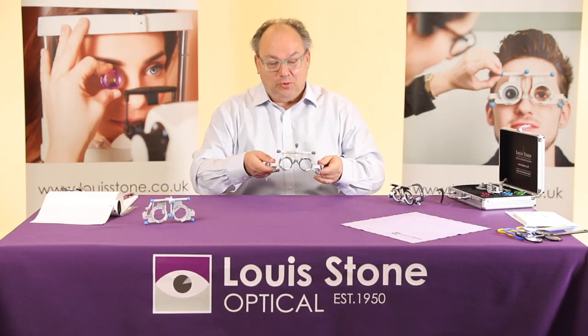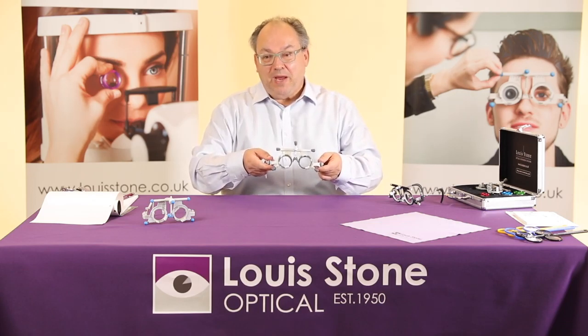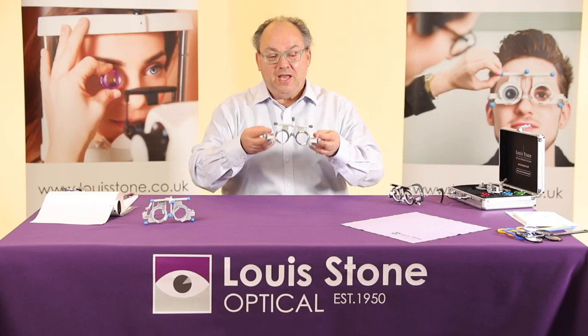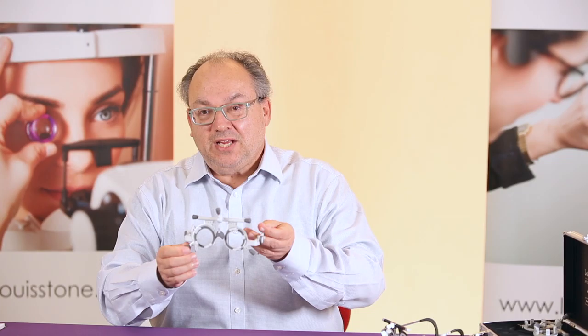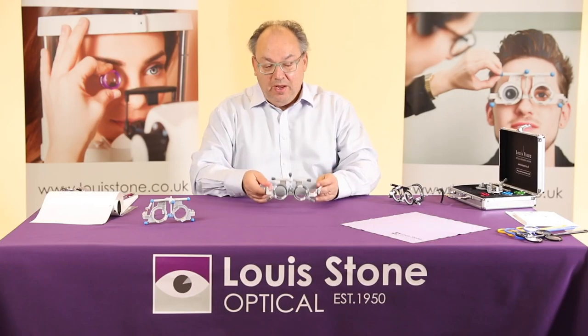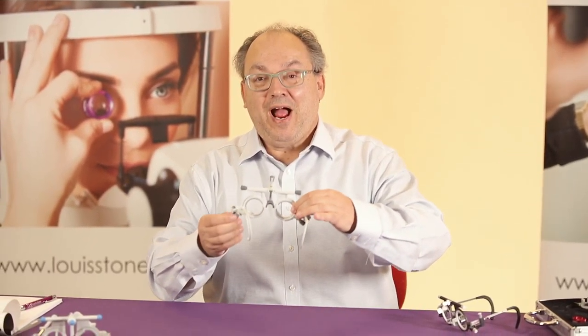This is the UB6, also from Oculus. This came out two years ago. It was made mainly because it doesn't use as many parts and it does look a lot more modern. It does all the things the UB4 does but with a more modern look. One big difference is it takes four trial set lenses at the front and two at the back.